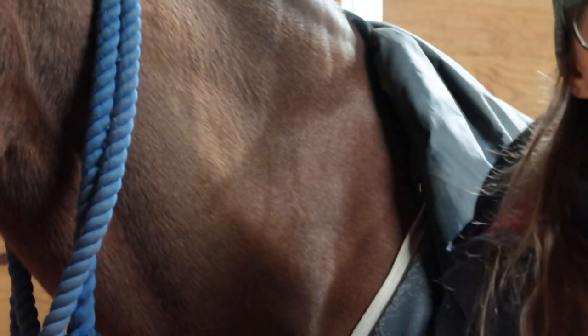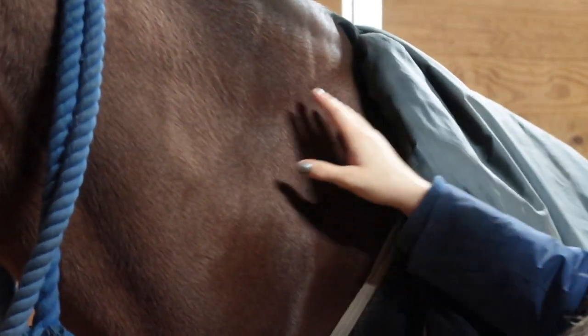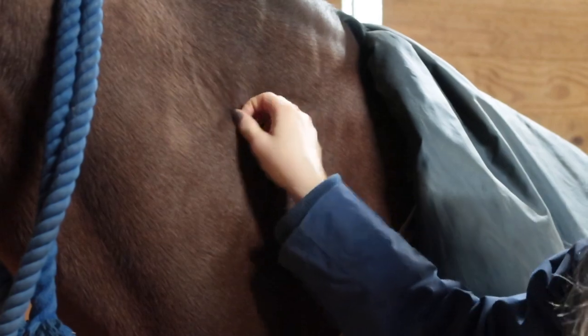Before we start, I want to make sure you guys know where to give any sort of injection in the neck — either in the muscle or for the skin, you can do it in the neck. There's this triangle here that is safe and there's usually no veins.